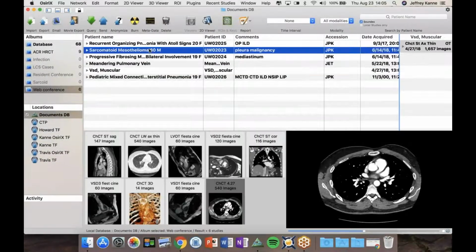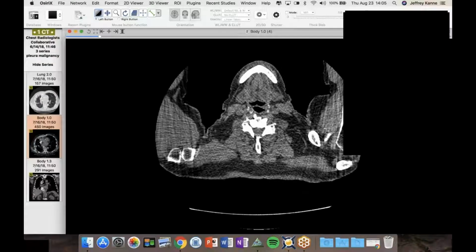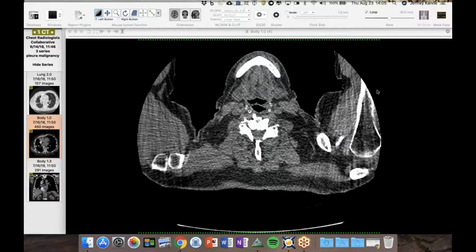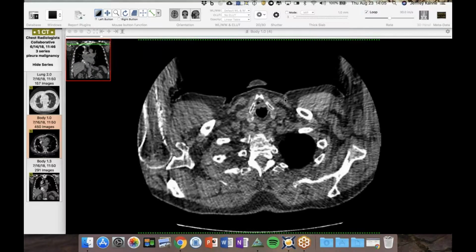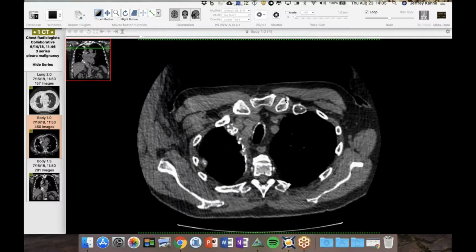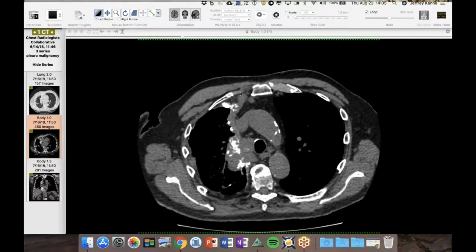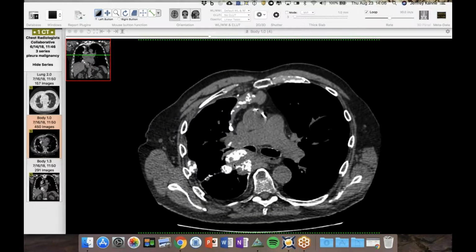Okay, let's see here. This is an interesting case. Unfortunately, I don't have biopsy confirmation, but I'm going to see what you guys think. You see a CT scan, yes? Yes. Okay, so this is an 80-year-old male who I was asked to look at the CT for my thoughts, and I don't know any history. I think he was having some chest pain. He's got this very thick rind in his pleural space with this really large, chunky calcification.